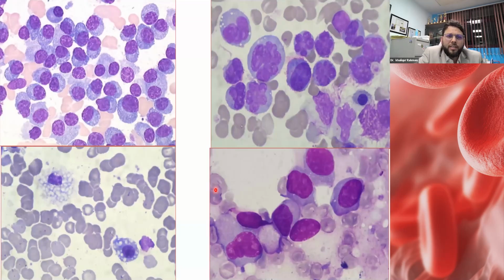These are the common run of the mill that we usually see in a plasma cell neoplasm: atypical-looking plasma cells, different in size with a high N:C ratio. We can also have a histiocyte kind of plasma cell, which looks like a pseudo-Gaucher cell. We can have plasma cells with multinucleation, flower-shaped cells resembling ATLL.